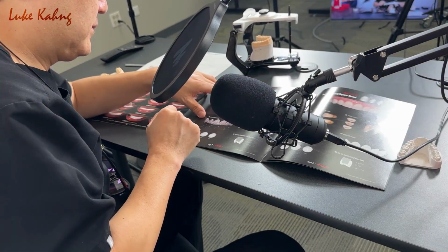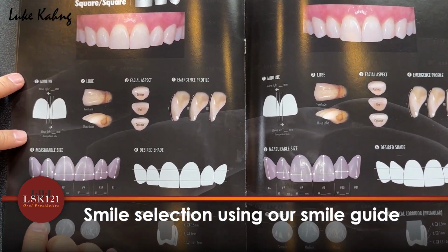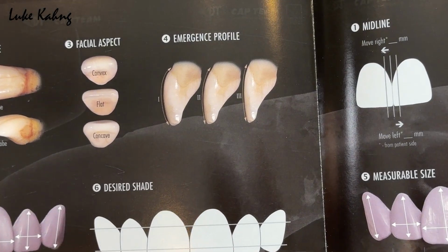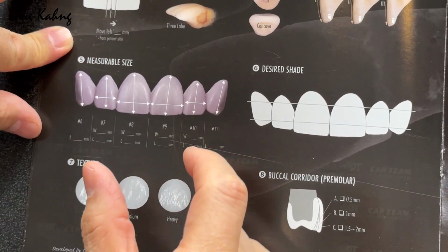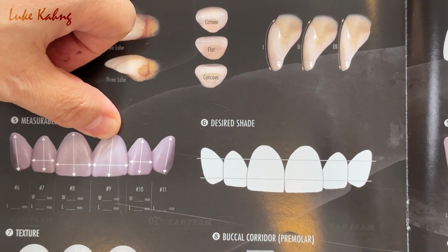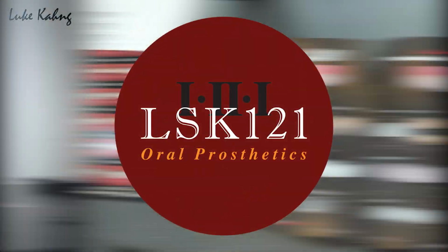Okay. You see, here is our internal things, and then once doctors make the square, we all the time check the midline and the lobe design, facial aspect, especially emergence profile. Sometimes there's a little issue creating the same thing, but the height compared to the gingiva all the way inside your desired color, we're trying to make that. Buccal corridor, surface textures, all in one together, so you can enjoy that.